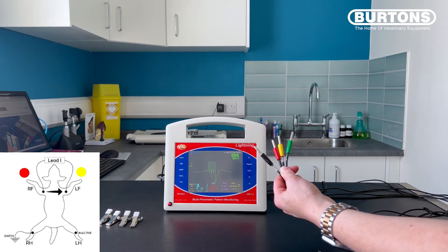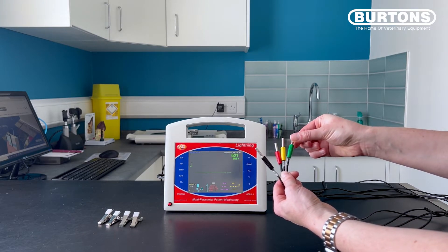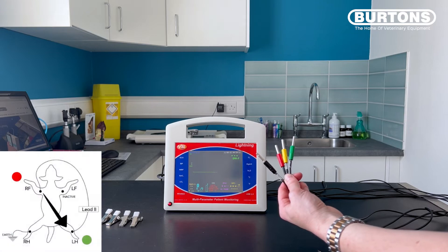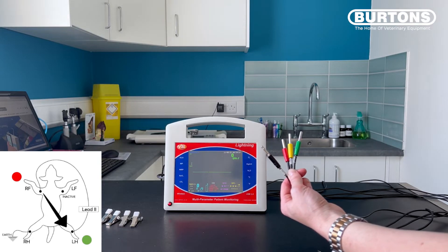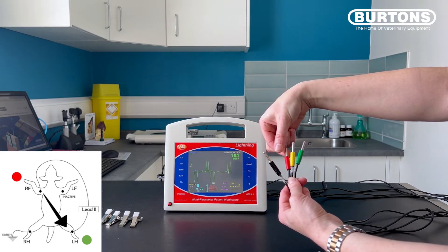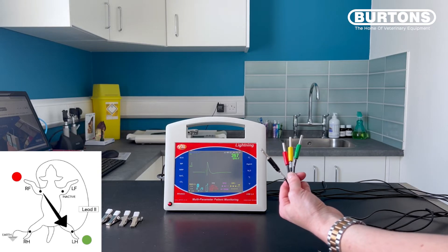Because the green electrode is inactive in lead one, if I touch it, there should not be any interference. In lead two, the active electrodes are green and red. Therefore, if I touch them and introduce a signal, we should get interference on our trace. There should be no interference when I touch the inactive yellow electrode.